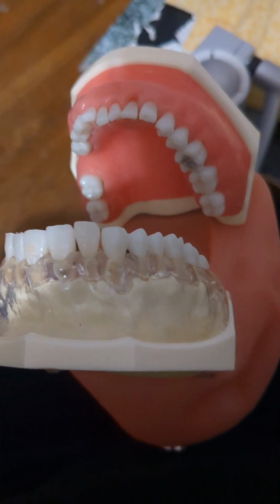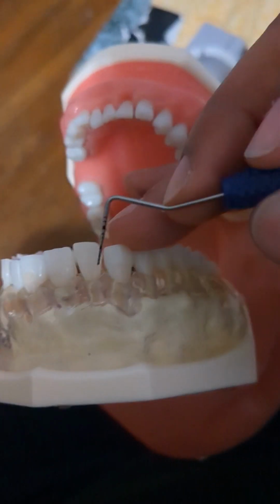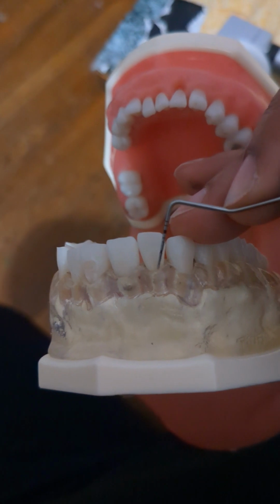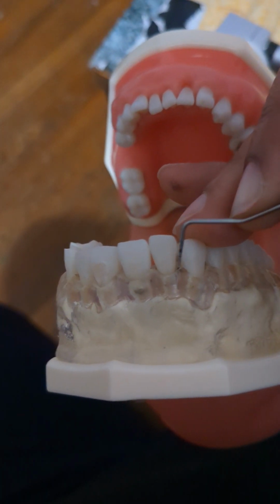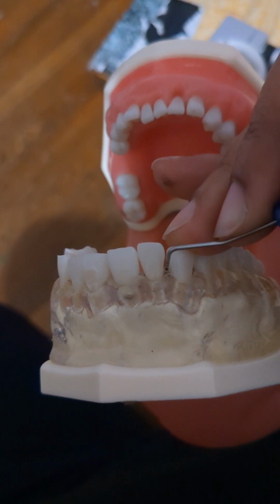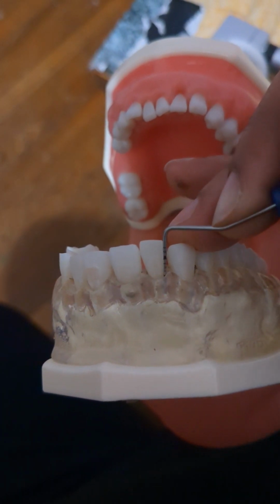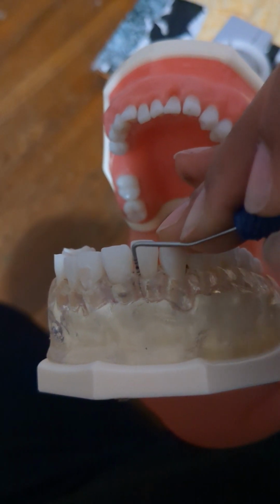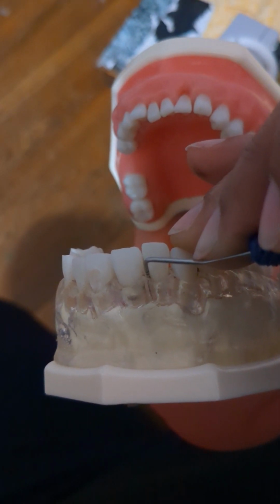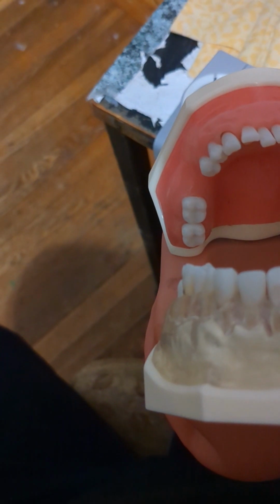Okay, now a lateral incisor. We have a bit of an 8, going back. 7 and an 11. Okay.